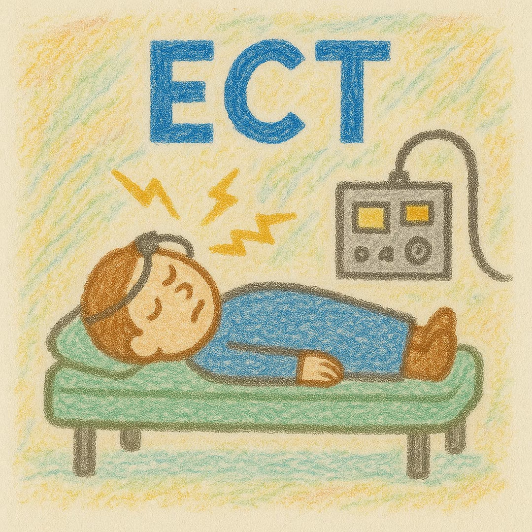You're going to have a cardiac monitor, so you're going to have EKG leads on. And then usually we use the cuff technique. So we're going to put a blood pressure cuff on conventionally the right ankle. I'll talk about that a little bit more later. Then we're going to do a timeout. And that's basically, right patient, right procedure. This looks like asking the patient to tell you their name and date of birth and that they're here for ECT. Sometimes you might be more specific and say you're here for bilateral ECT or right unilateral ECT, something like that.